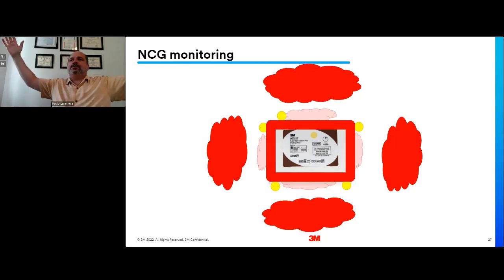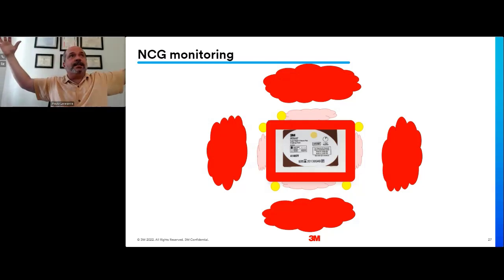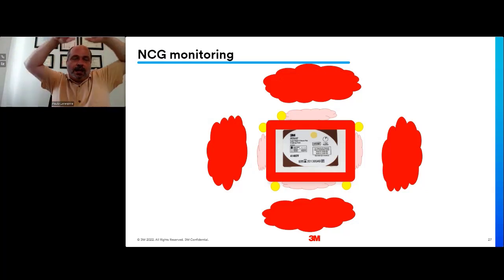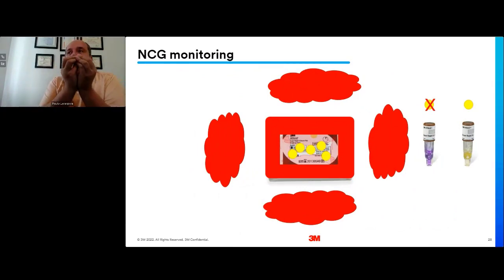So I have a huge cloud of steam. When it condensates, it's going to be a drop of water. When I have that drop of water, the area that I had steam has to be filled with something. If I have only steam, steam is going to be drawn to that void. But if I have air, air is going to go to that void. That's why we are able to drag air into the PCD to the point that air is going to be concentrated inside of the PCD.